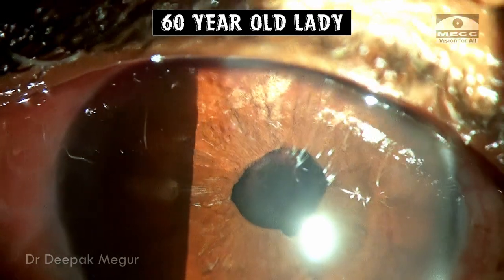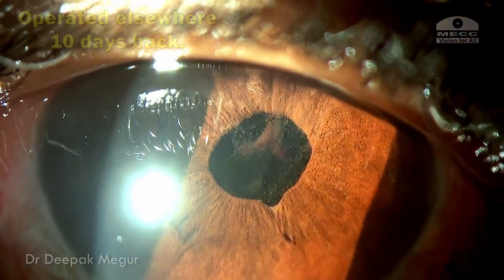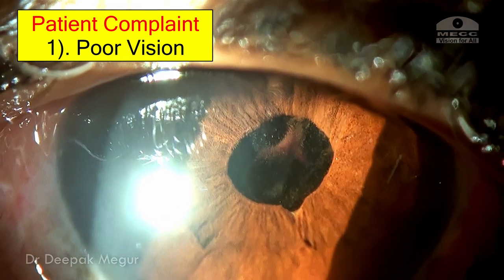This is a 60-year-old lady who has undergone cataract surgery about 10 days back and her main complaint is poor vision after surgery.